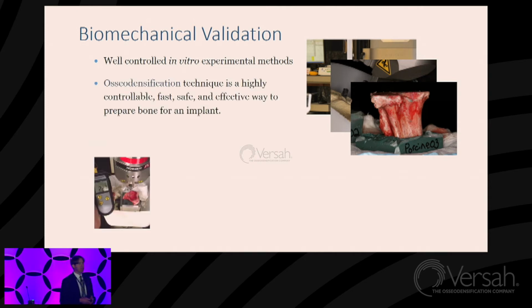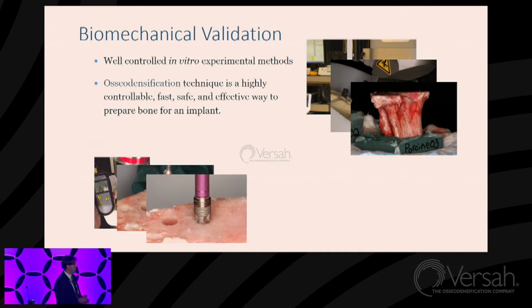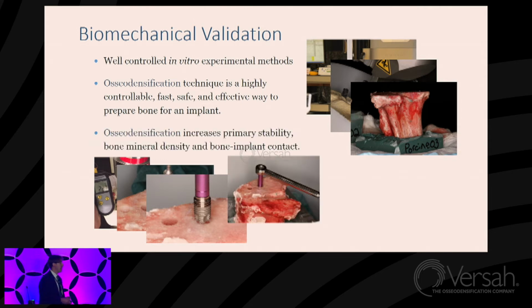And then one of the first goals was to verify the clinical safety and the ability to control this procedure as a function of time, control the heat generation as an effective way to create the osteotomy for placing an implant. And so we measured heat generation, we measured the drilling process, we measured the implant process.